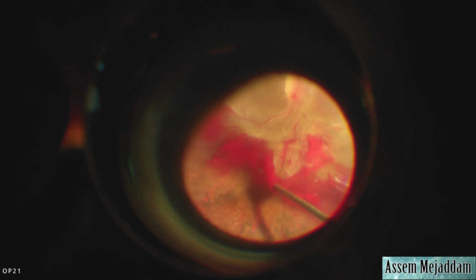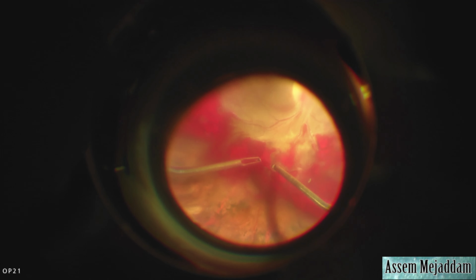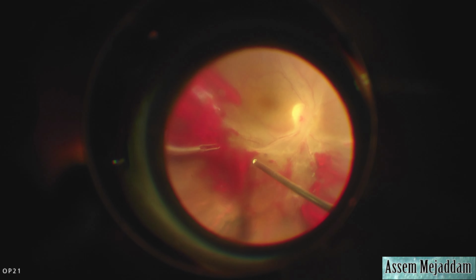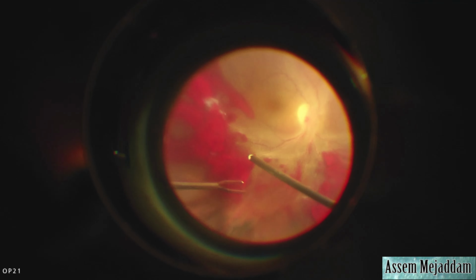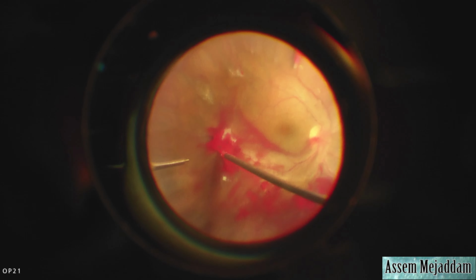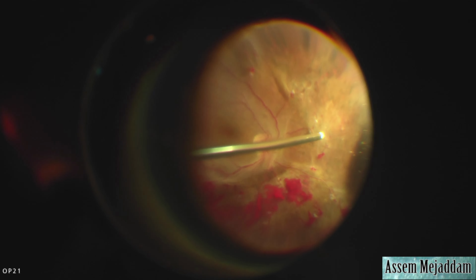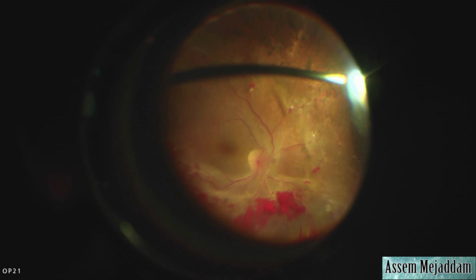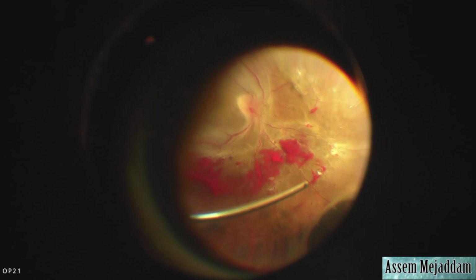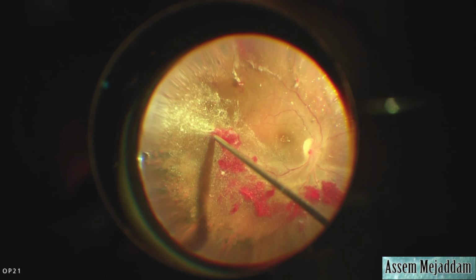So most of those membranes are gone. That blood becomes a very adherent membrane onto the retina, and so one needs to dissect it as well. You can't just aspirate it from the retina. And so here I'm making use of a flute needle with a silicone soft tip, then doing some more peripheral vitrectomy, making sure there's as little anterior vitreous left as possible that the membranes can attach onto.